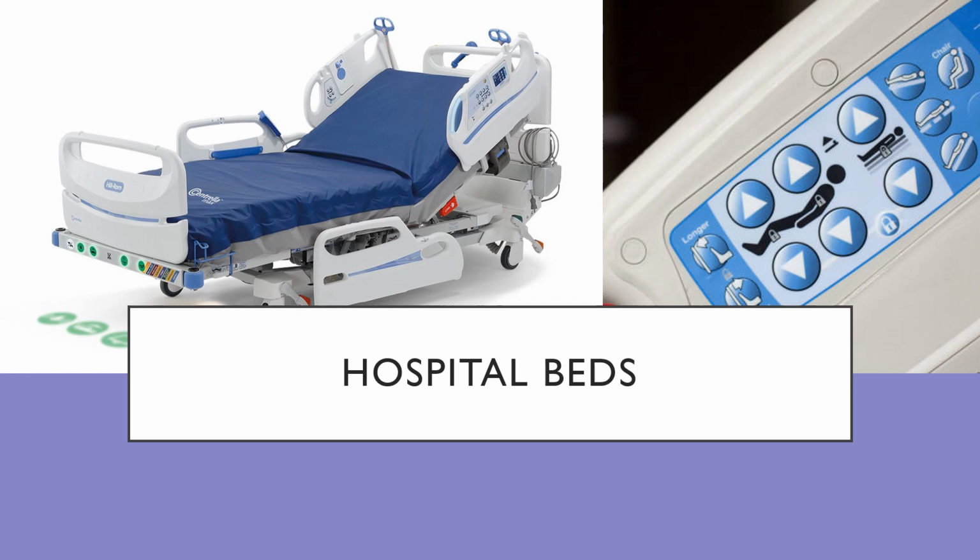Controls can also be used to place them in a Trendelenburg position that makes it easier for the patient to slide to the head of the bed or reverse Trendelenburg to slide to the foot of the bed. The bed can be raised or lowered to the waist height of the healthcare worker to reduce lower back pain from bending over the patient when performing patient care.